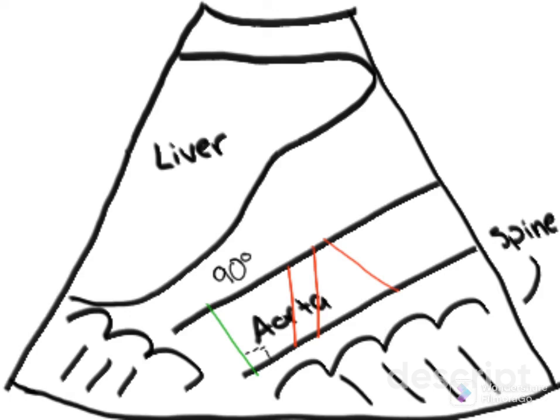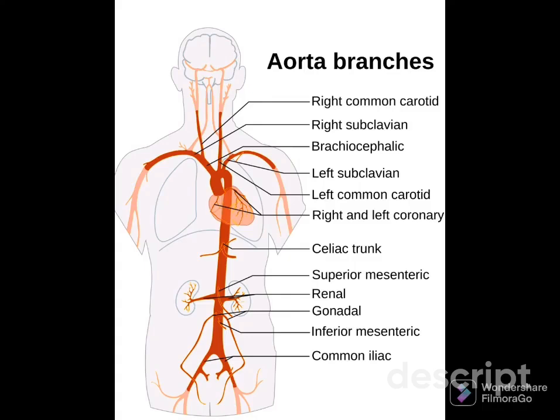Those measurements are inaccurate because they are not 90 degrees with the vessel wall and they are not measuring it on the outside of the wall. So, with aorta or any kind of arteries that we are measuring, we're measuring from outer to outer wall to make sure that we do not have an aneurysm whatsoever. All right, I believe that concludes the abdominal aorta protocol with ultrasound.